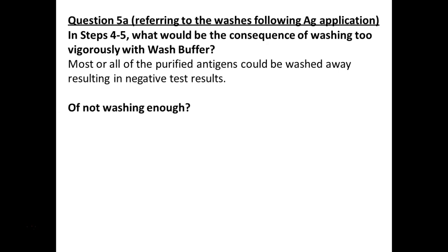What if we don't wash enough, though? Yeah, it might get too crowded, so that when we add other stuff, the stuff that isn't bound binds to our other stuff, and we end up washing it away. So it wouldn't necessarily make our tests inaccurate as far as positive or negative. We will probably still get positive results if it is truly positive, but it won't be at the same level, because some of our stuff would be removed by the stuff that wasn't bound.